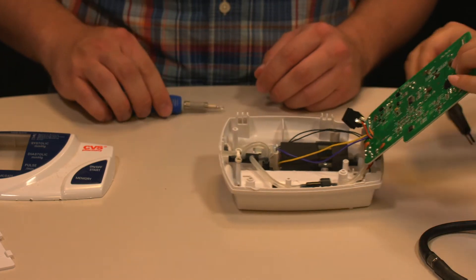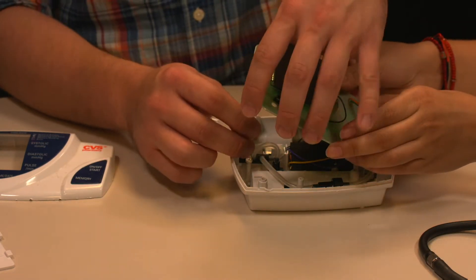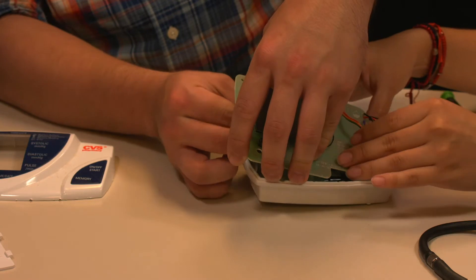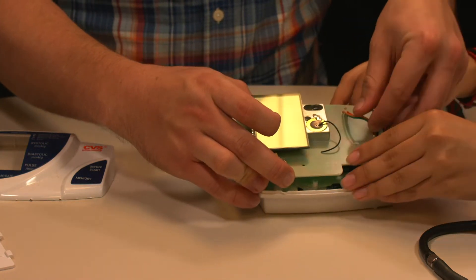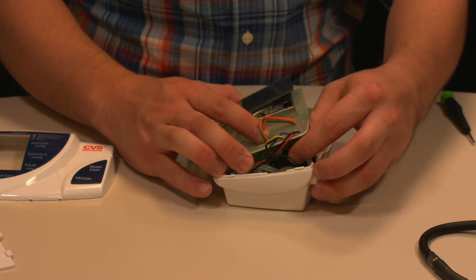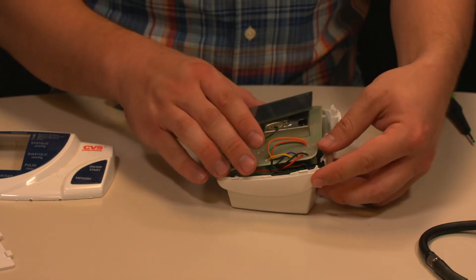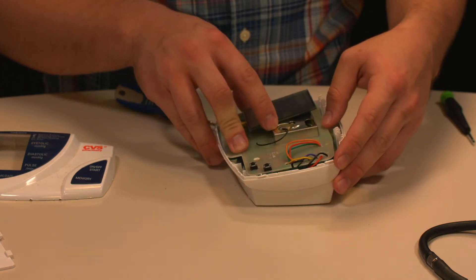The next step is to put the circuit board back on top. There are plastic connections that should snap right back down. Make sure everything internally is connected and that the adapter is seated before screwing everything back in. There is a slot on the side of the circuit board where all the wiring can go, which helps to have everything in one spot.